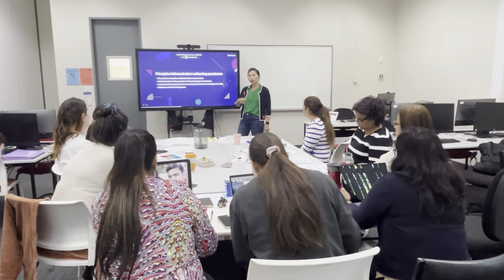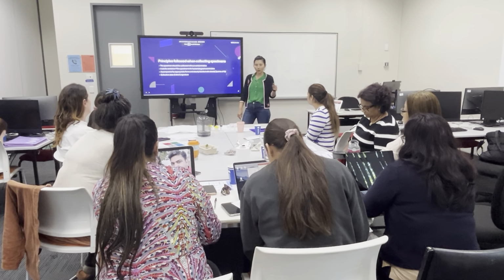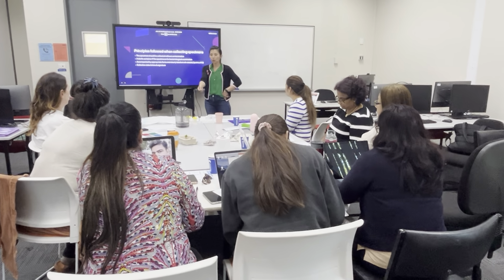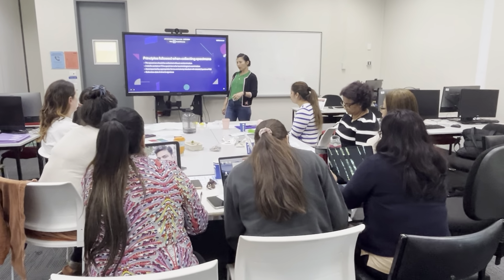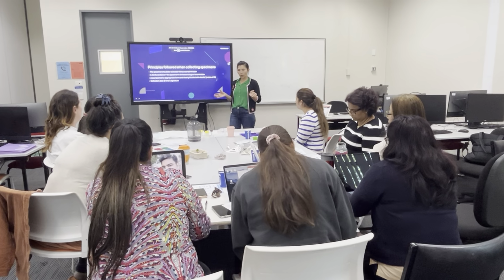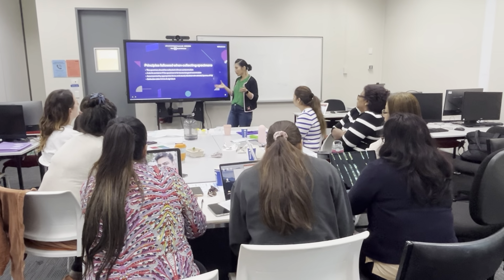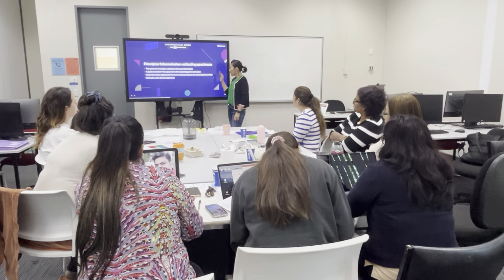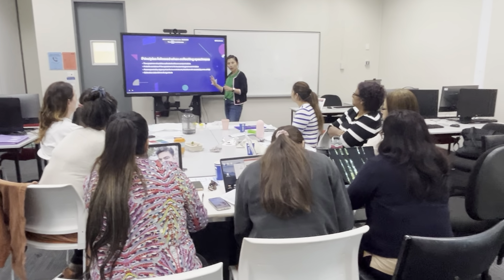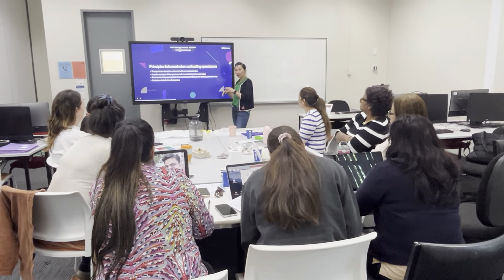So a patient comes and shows you the ID, that is the patient's wife, or patient's husband, or himself. If a patient says, my wife told me to drop off this specimen, and I say, oh, who are you? And then he shows, oh, this is me. And look, oh, this ID is not you. So whose specimen is it? It's very important you always make sure the specimen comes with the right form and with the right ID. And also you follow the correct procedure for collecting those specimens and sign it off.